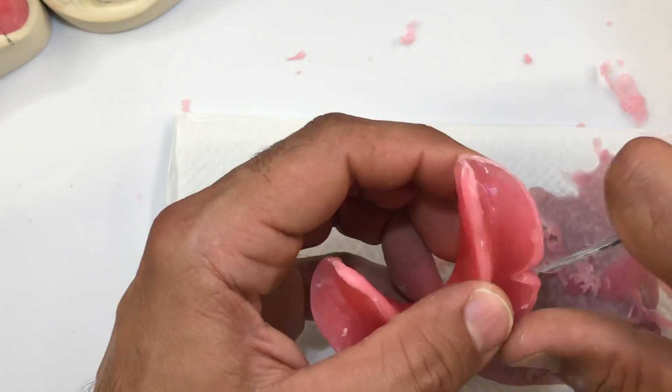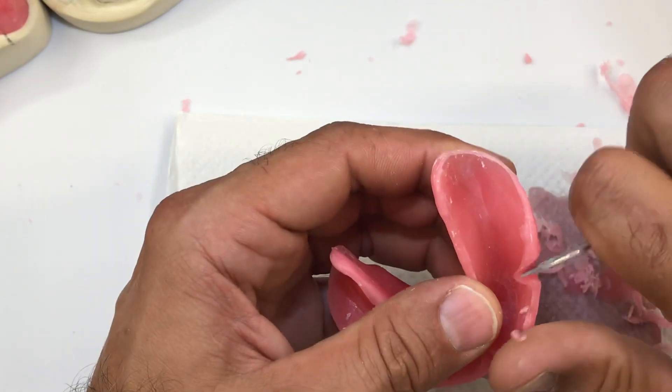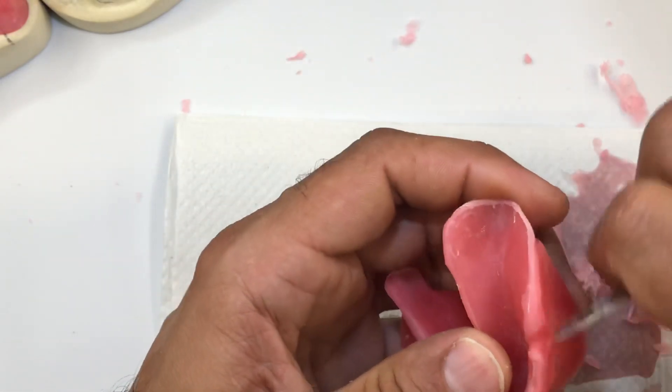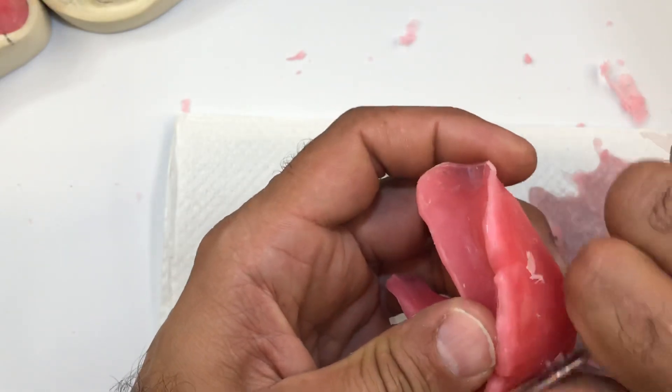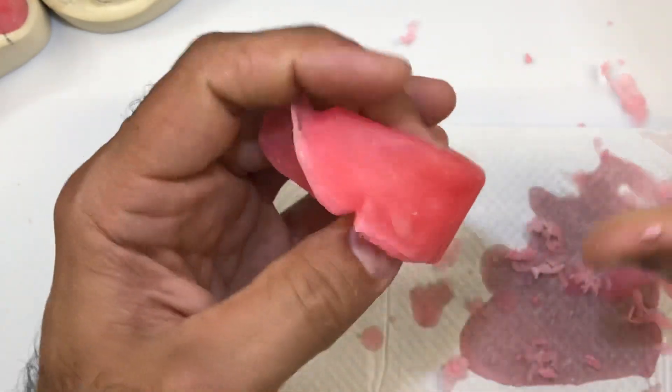Now we're getting really close to finalizing this lower bite block. Before you adjust the width of the bite block, make sure you adjust the height first.